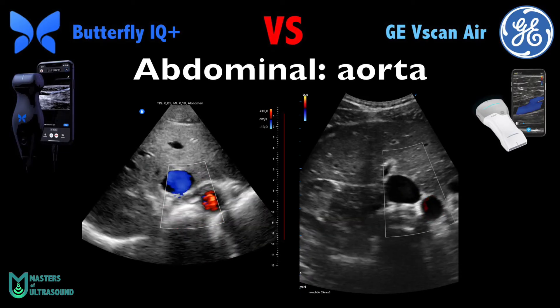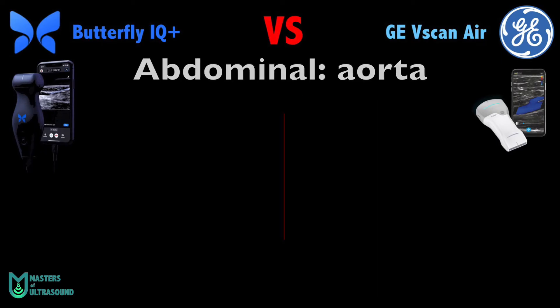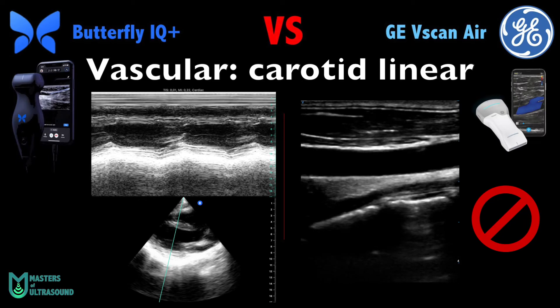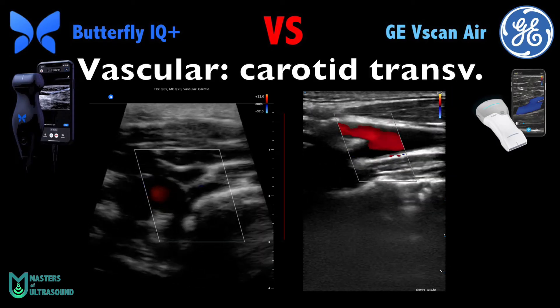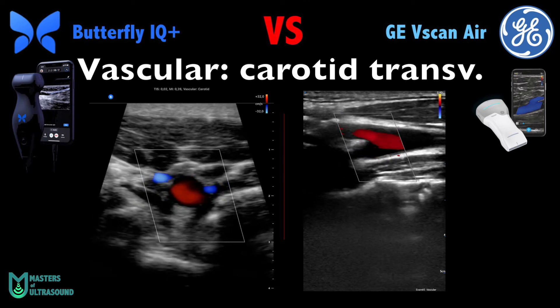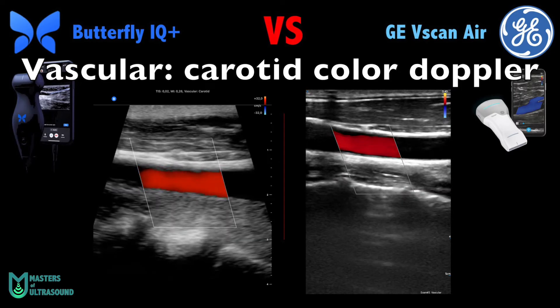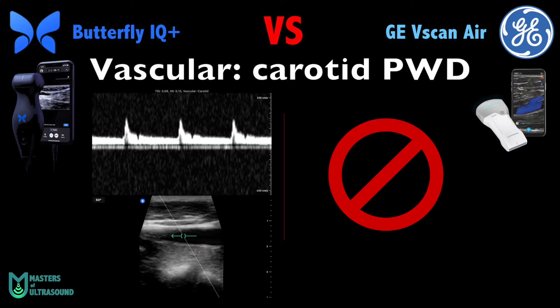Here you can see that both Dopplers are pretty much the same. The Butterfly IQ has M-mode — here shown on a carotid image and a cardiac image — while the Vscan has only B-mode. This is a transverse carotid color Doppler, and you can see that both are pretty similar. This also shows that the Butterfly IQ has Pulse Wave Doppler, which the Vscan does not have.